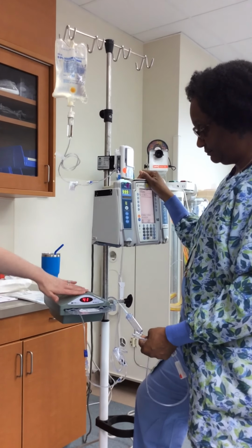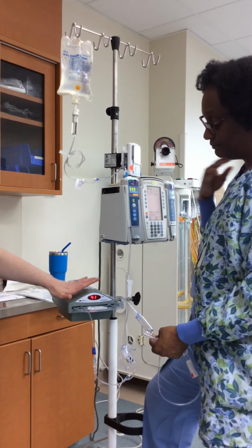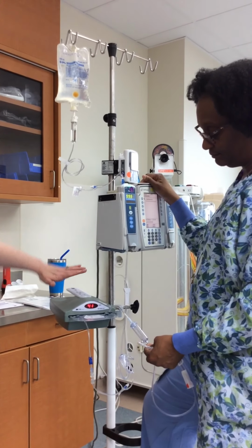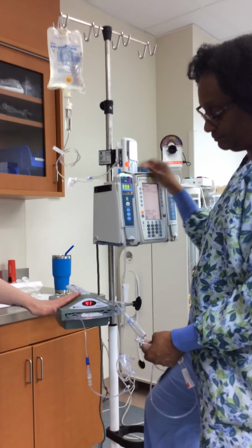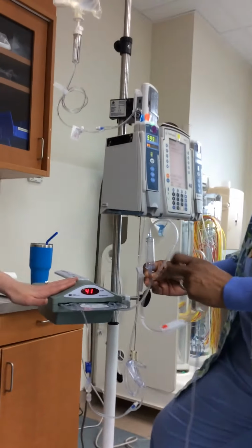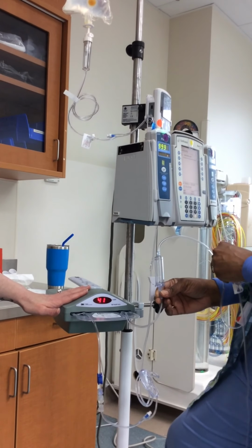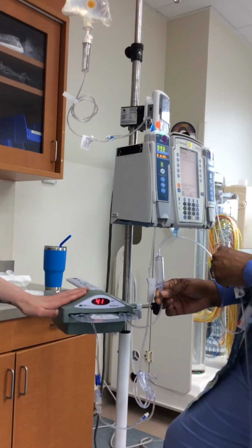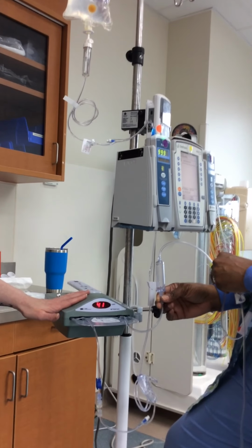But a couple of other things they did tell me about this machine. It will self-regulate to 41 degrees. If there is fluid inside of it, it may go up and down a little bit, but it will self-regulate. If you turn the machine on and you do not have a cassette in it, it may overheat, in which case it'll alarm for you, and you would just need to turn it off for about 30 seconds to a minute and then turn it on.